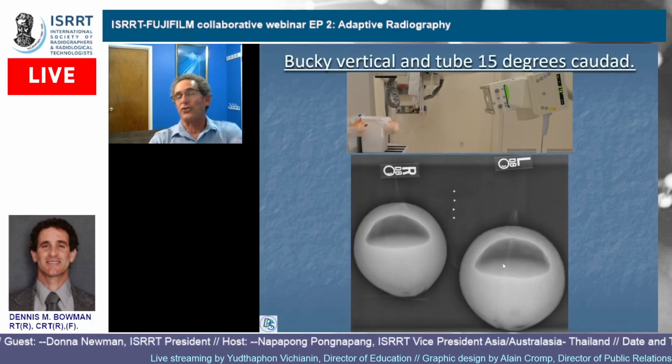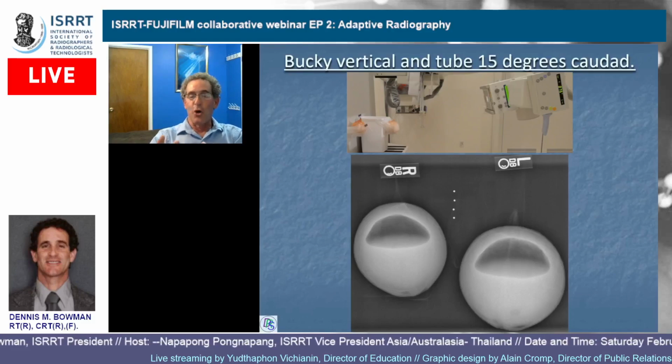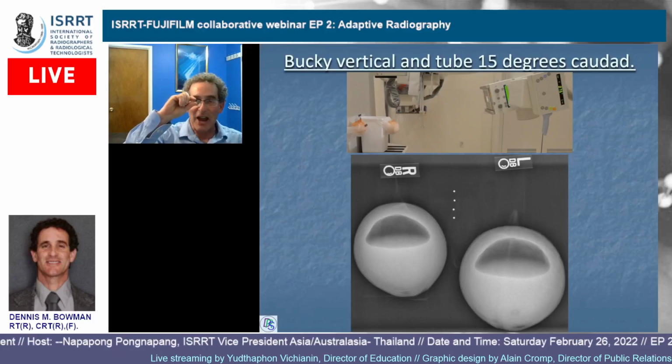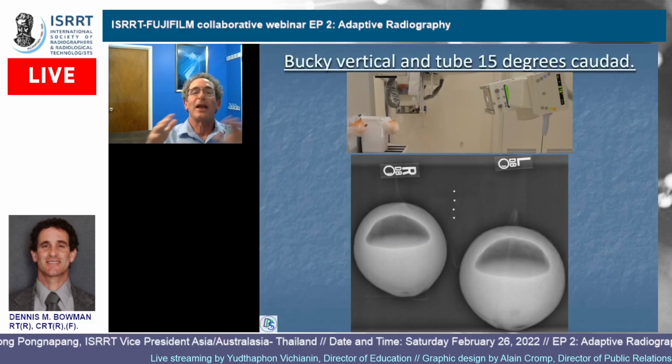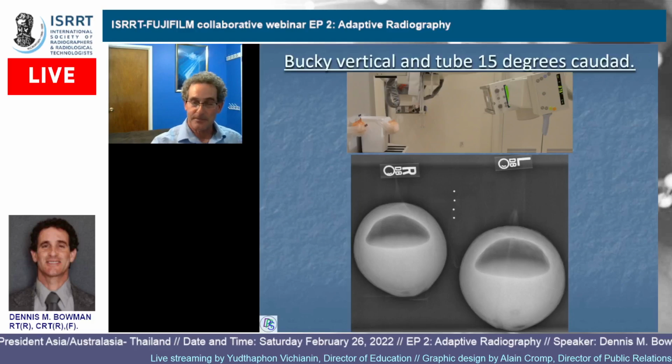Now you could still say, well, I can still totally see there's an air fluid level. Yeah, but we're looking at a coconut half full of fluid. How about if it was a small intestine with just a little tiny bit of fluid, or a sinus with a little bit of fluid, or something like that? And then you can go, hey, that much distortion could also just disappear it.